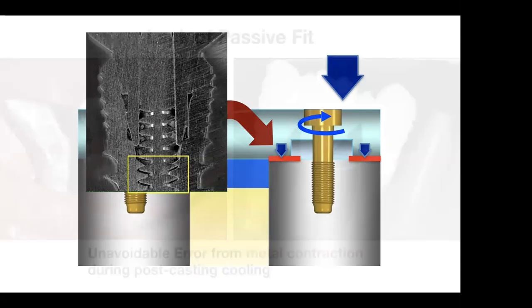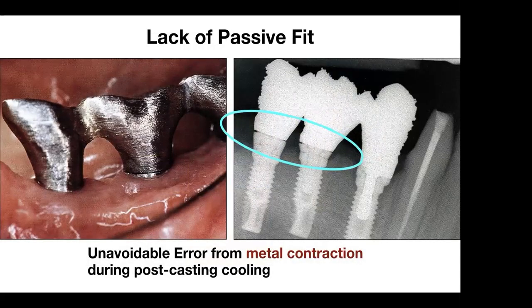Actually, this lack of passive fit is reported throughout the history of the implant pretty much.